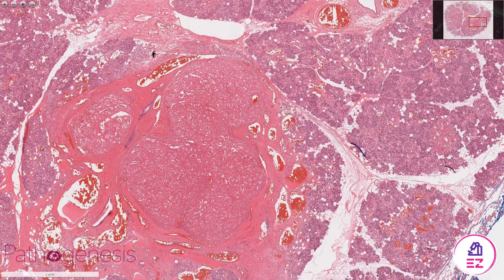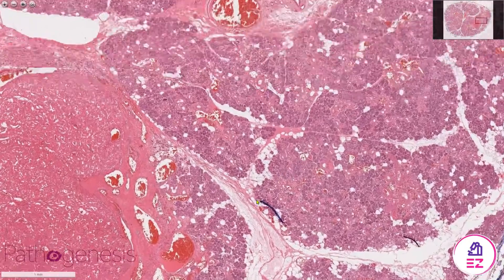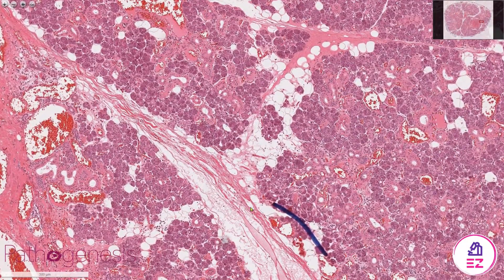This is the tumour in question — the oncocytoma — and around it we have some normal parotid. We can see some ductal structures, the serous acini, and some intervening adipose tissue.